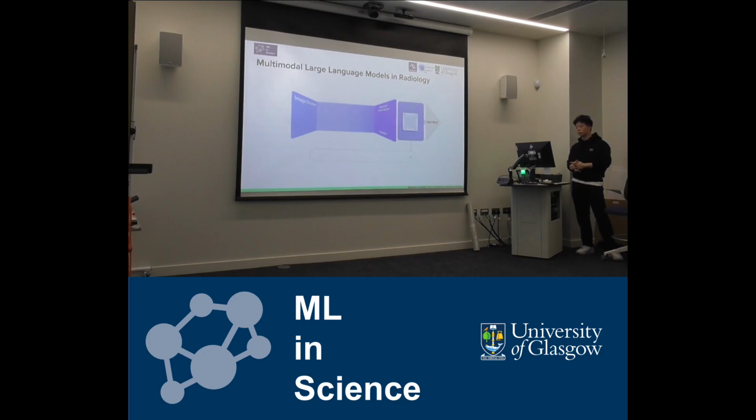My research explores how to apply this kind of model to the radiology domain, specifically for chest X-ray. I'm not handling CT scans or other modalities. So the setup is very simple here: chest X-ray as an input, and the output will be a response generated based on the specific medical question, not just a normal question.